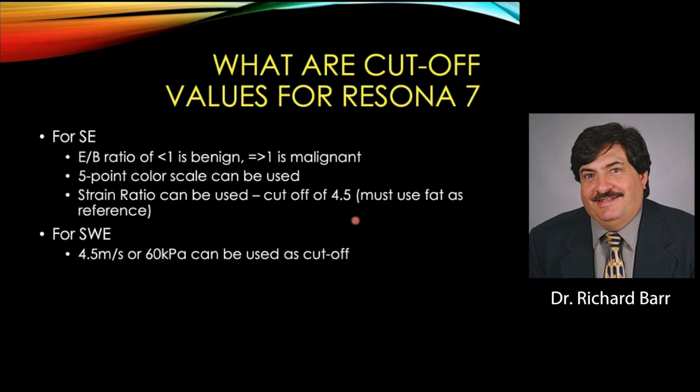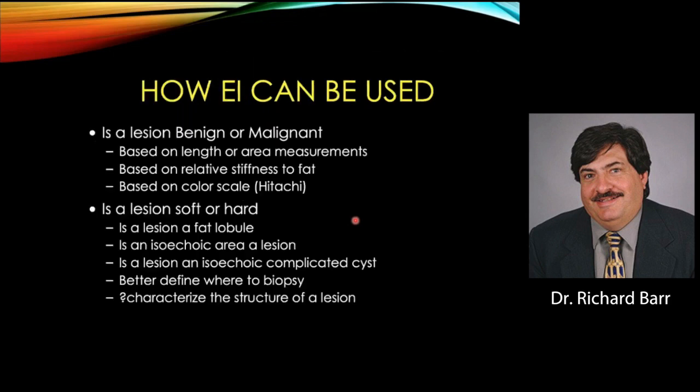I will tell you that a lot of people like to use 3.5 meters per second to make sure that they don't miss a cancer, but I'll talk to you about how I combine strain and shear wave to help avoid that. So how can we use elastography?